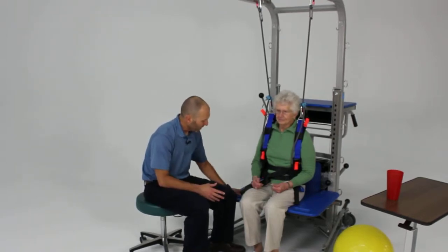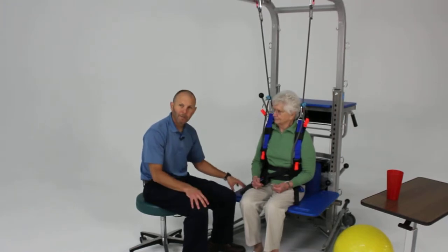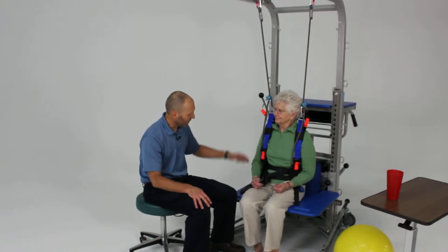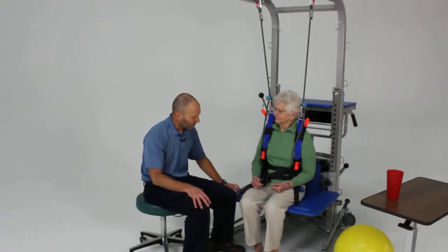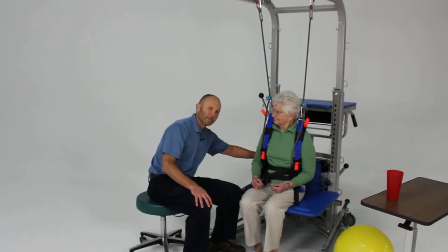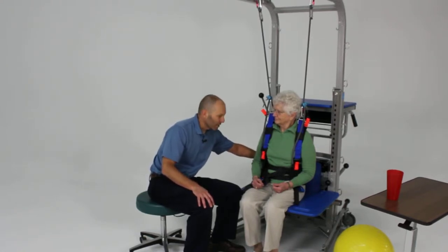With the bench attachment in place here, we've taken the bench from the back of the unit and placed it on the arm support, providing a bench surface. It provides a very stable surface for a patient to work on early sitting balance. There's also a little bit of support from the back pad here that gives them a little bit of a sense of control as well.